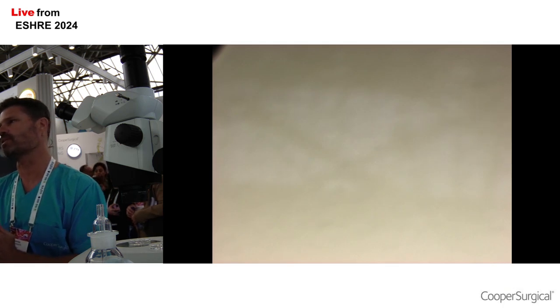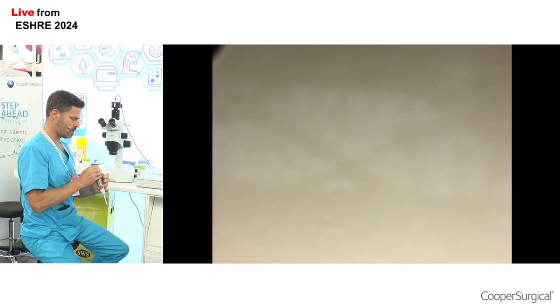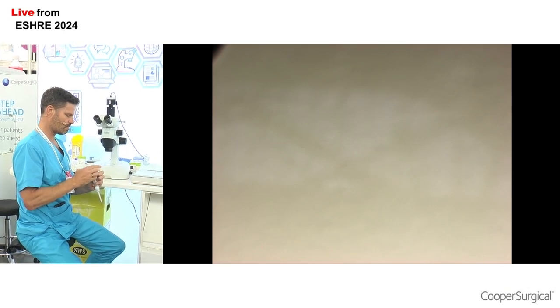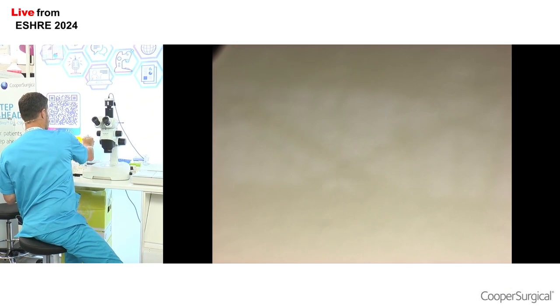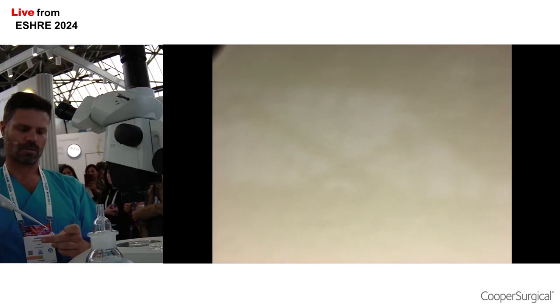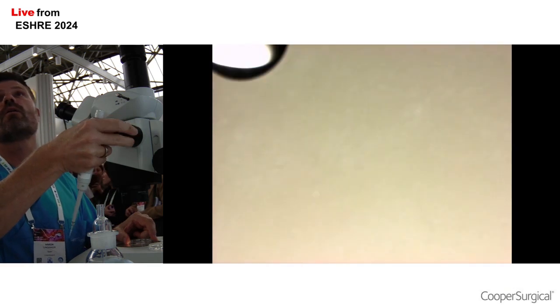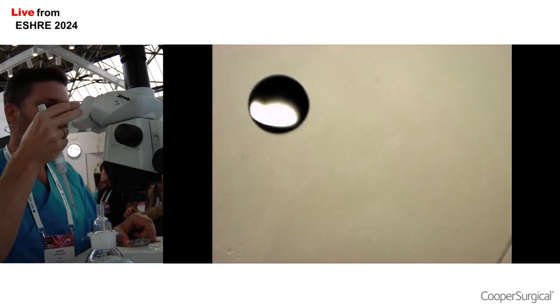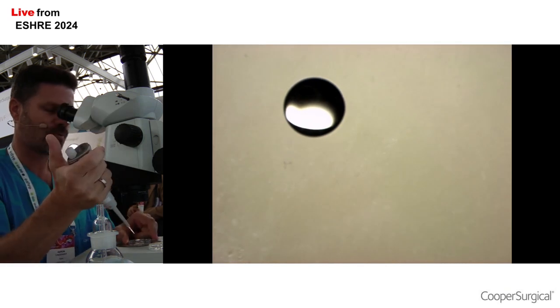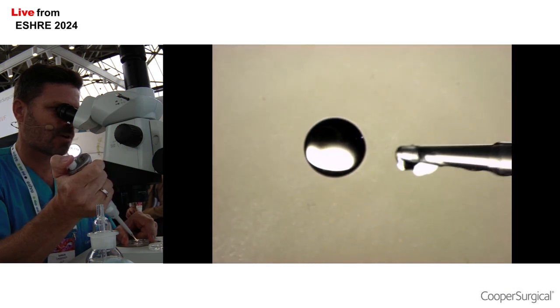SpermSlow is like PVP, it's a viscous material, but the viscosity comes from the hyaluronic acid which is in it. And what I'm going to do here now is, like I said, a very small drop, between 2 to 5 microliters. Okay, so there's my drop that I prepared. I'm going to place, on the right hand side of this drop, a very small drop, 2 microliters of SpermSlow, okay?